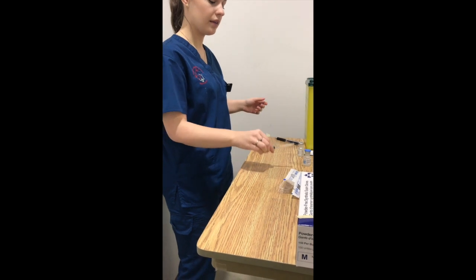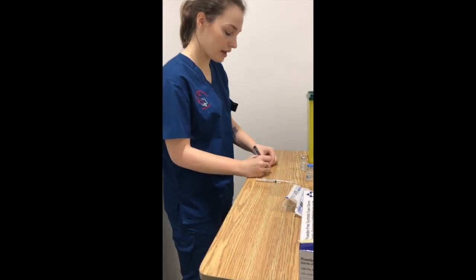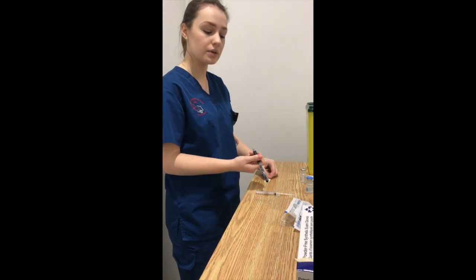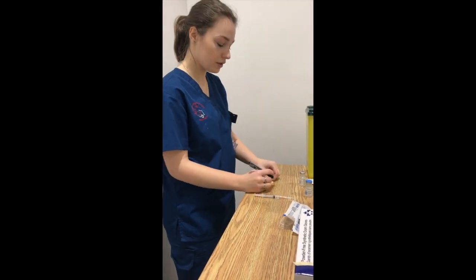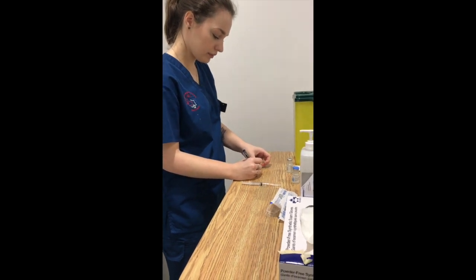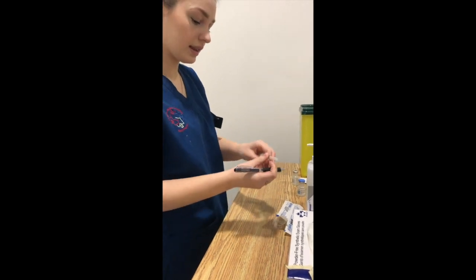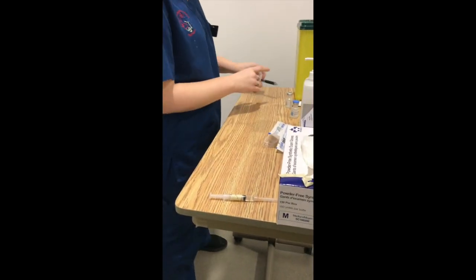Along with preparing the medications away from the bedside, it's really important to write a quick little label of what the medication is as well as the dose, and label the needle so that you know what you're bringing into your patient's room. And then we're just going to label it like that, and then we can tuck that to the side.